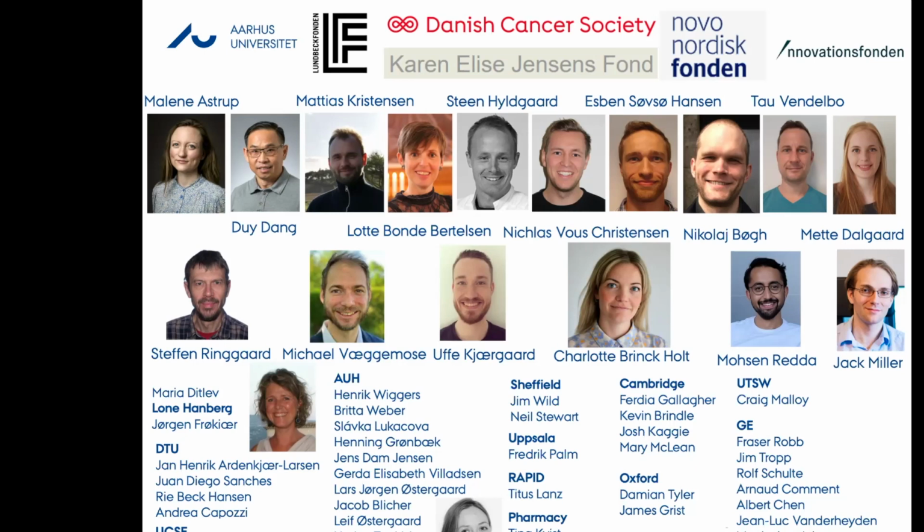So it's more for this. You can buy all of this stuff, right? If the clinical indication is there, I don't see any barrier for anyone to enter. I mean, of course, we're always at the fringe of SNR and resolution, right? You still need to draw the ROIs and evaluate your signal, and the better your voxels are, the more accurately you'll be able to quantify metabolites and stuff.